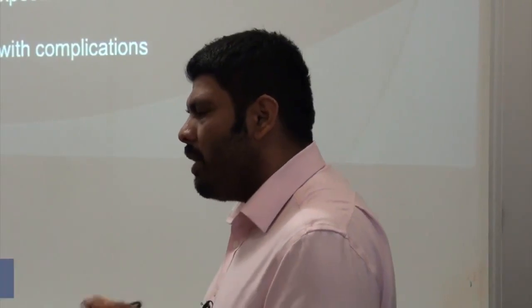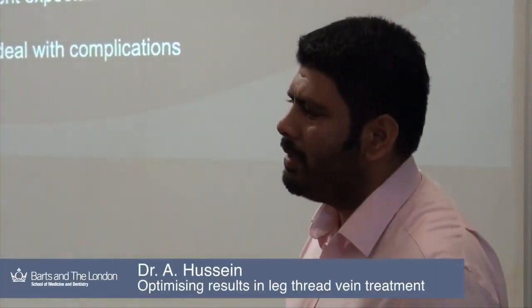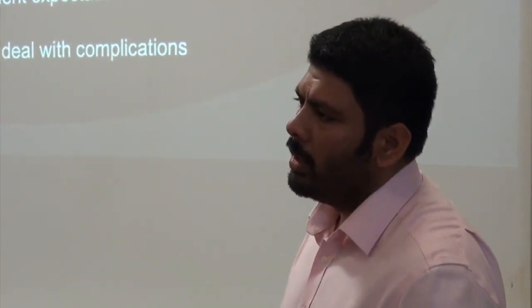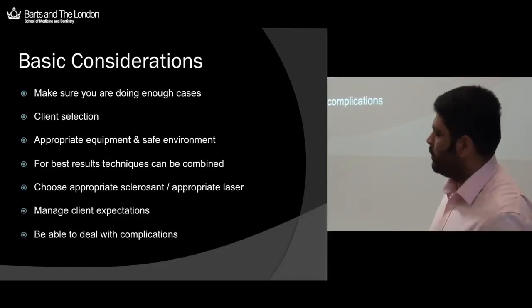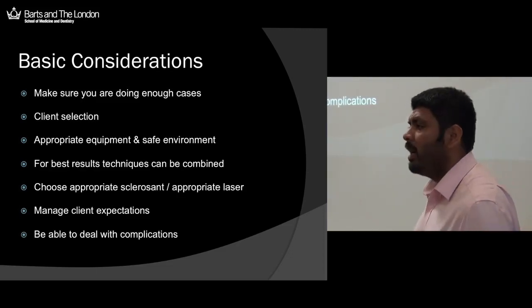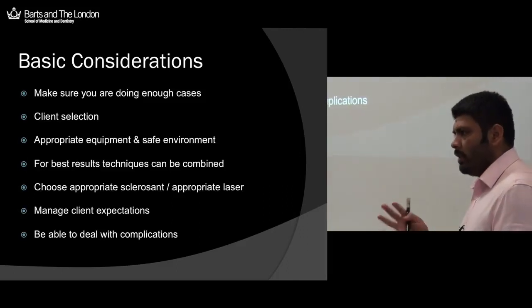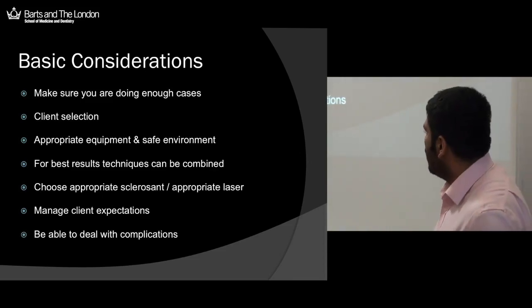Remember, there are multiple techniques to treat leg veins. So we talk about sclerotherapy very often, but we do have other ways in which we can treat. Long pulsed Nd:YAG lasers, I'll talk about that shortly. Diode lasers are a good way of managing telangiectasia and even slightly larger reticular veins to a certain extent. So we'll talk a little bit about the choices and how we make that choice.